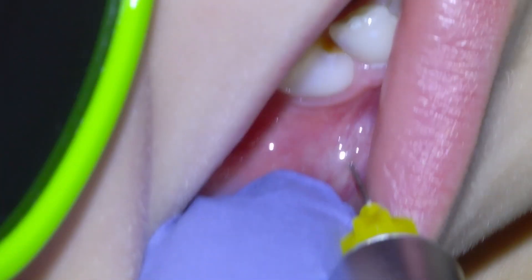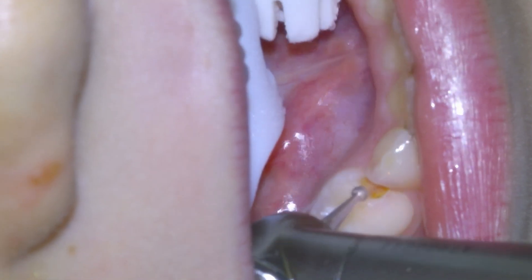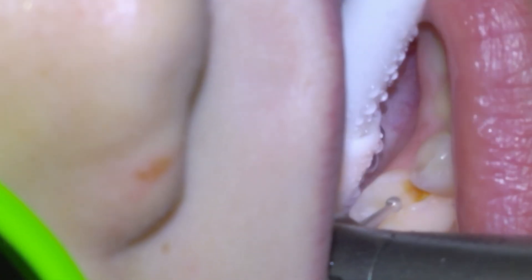Once we've waited a few minutes for the freezing to settle in, we're going to go in with a medium round diamond on a high-speed handpiece and add an occlusal dovetail as a retentive feature to prevent the filling from debonding. Then we're going to go in and remove the tooth decay with a small carbide burr on a slow-speed handpiece.